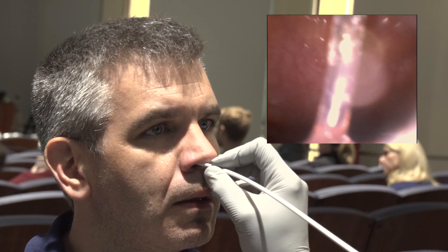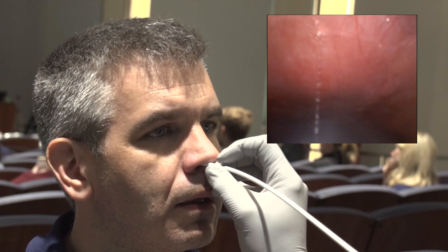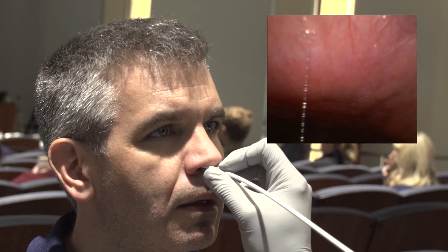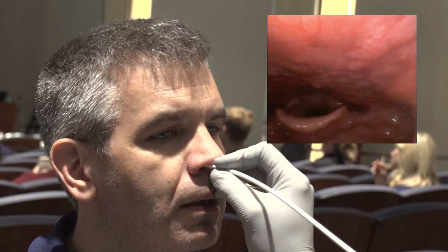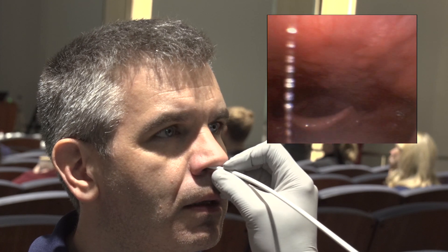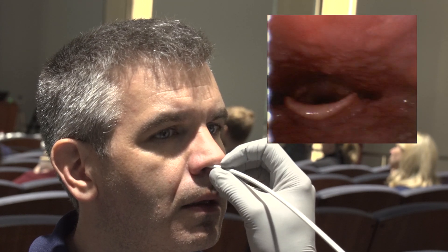Identify the posterior oropharyngeal wall and push the control lever up with your thumb, which will cause the distal tip of the scope to point down. Identify the epiglottis and the base of the tongue.